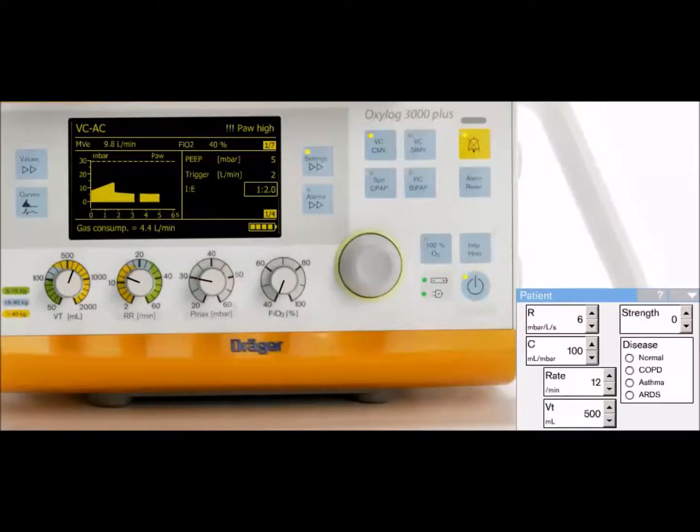Second, does this mode have the functionality that all breaths are spontaneous with sufficient patient effort? So when the patient starts triggering breaths, do all the breaths turn into spontaneous breaths? I started to have the patient breathe. I have my mandatory breath. I have a spontaneous breath. But as you notice, there's another mandatory breath. So not all breaths are going to turn into a spontaneous breathing pattern. So it does not have this functionality either.